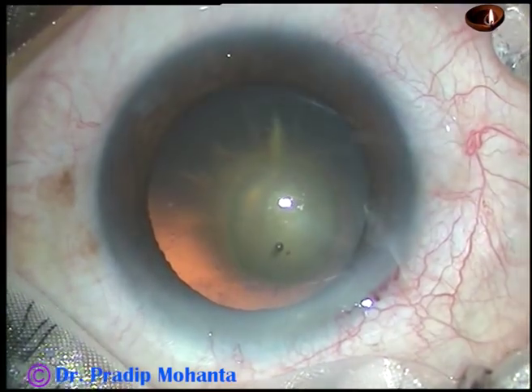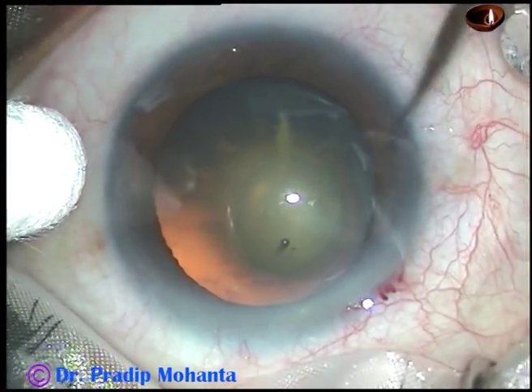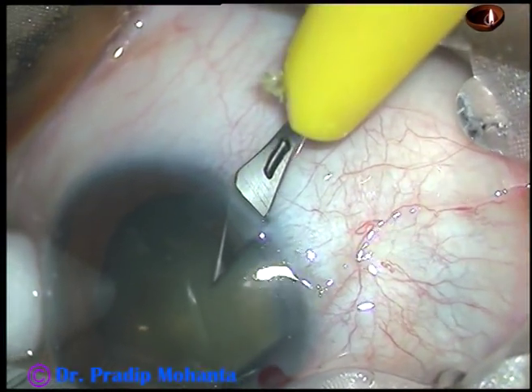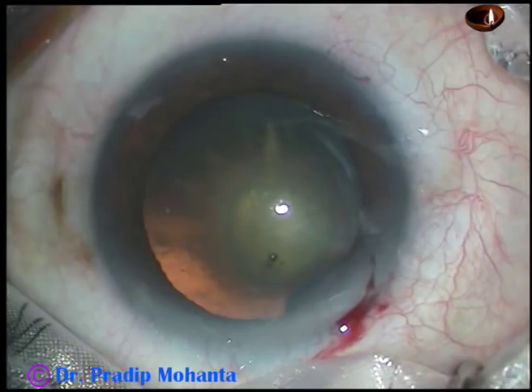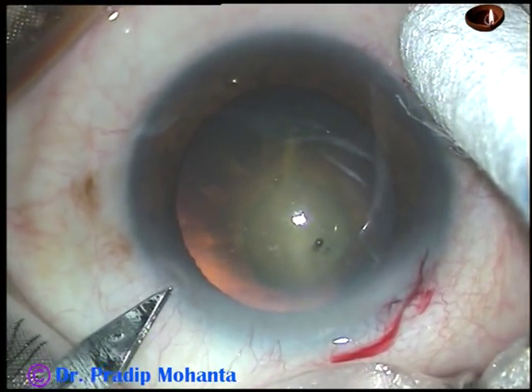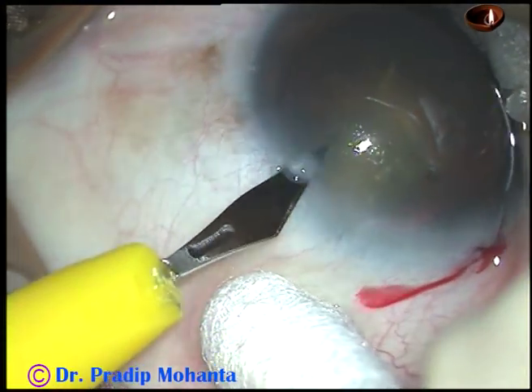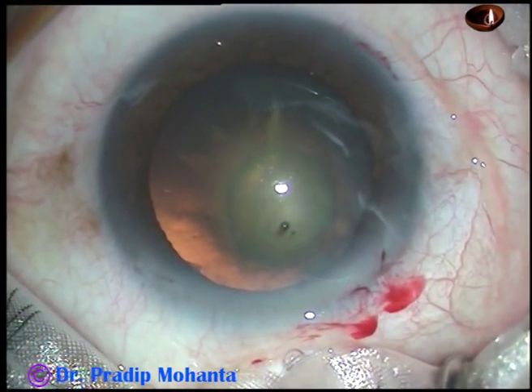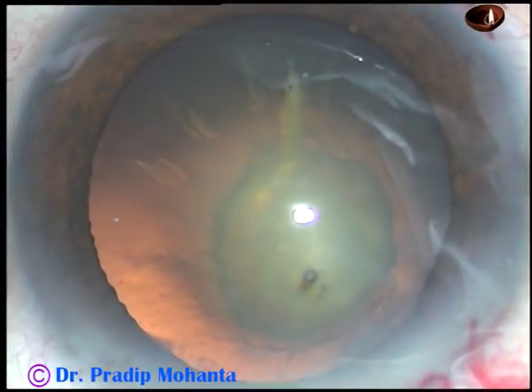By this time, the main incision has been done. This viscoelastic substance has been injected into the anterior chamber. This is a side port about 2.5 o'clock hours away on the right side, and this is another side port about 3 o'clock hours away on the left side. And now, capsulorhexis is to be done.